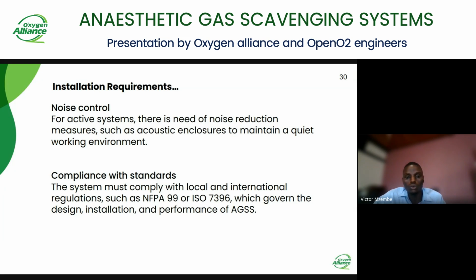Finally, you also have to comply with standards. You have to make sure that the system complies with local and international regulations, such as ISO standards as well as NFPA standards. These standards govern the design, installation, and performance of anesthetic gas scavenging systems.